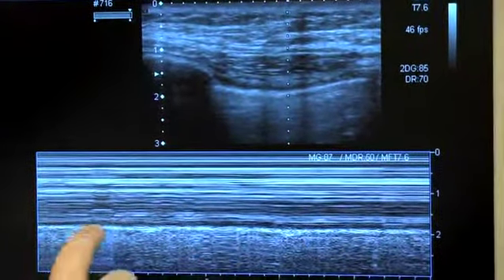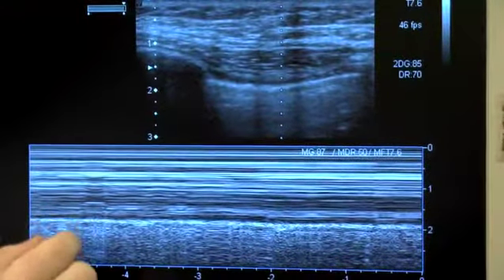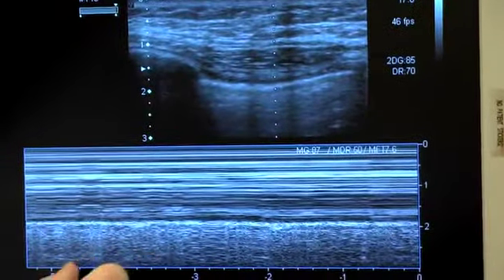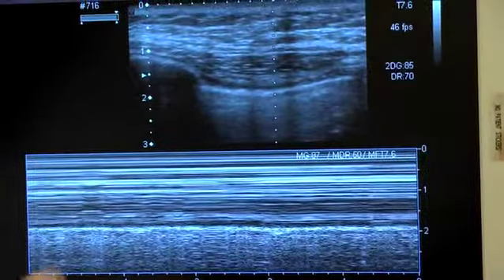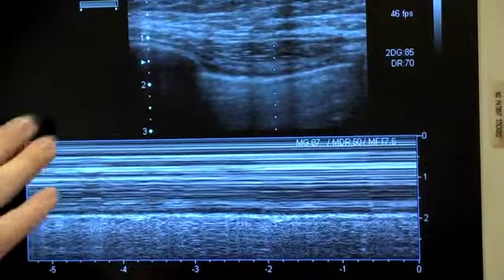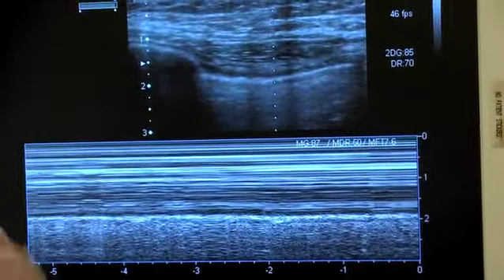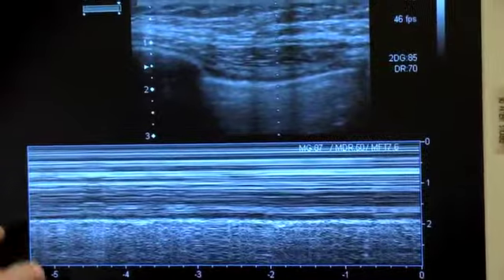At the pleural line, there's motion between the visceral and parietal pleura, therefore it shows a lot of motion on the screen, and therefore it excludes pneumothorax, whereas there's not a whole lot of motion in the intercostal muscles or chest wall. If there was a pneumothorax, there would be no beach. The whole screen would almost look like what's called frozen echoes, because there's no motion along this interface. So the whole screen would just look frozen.